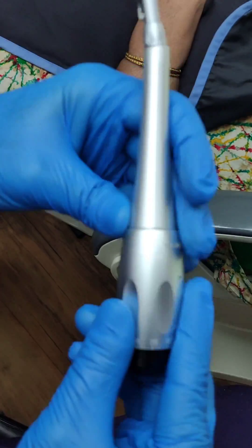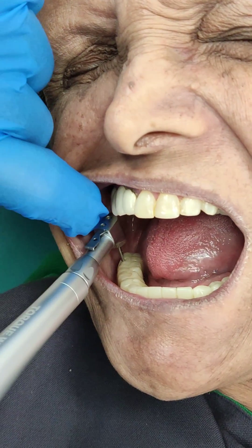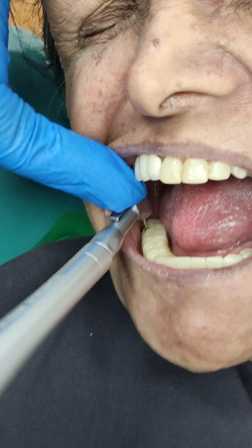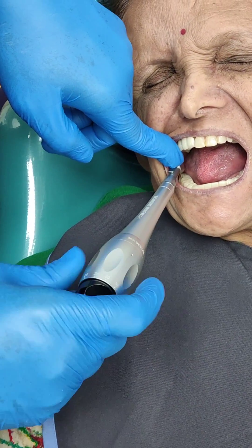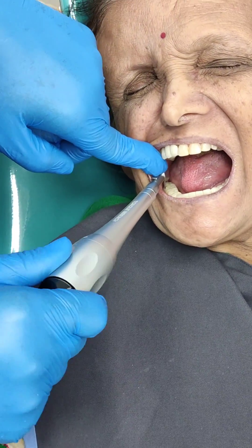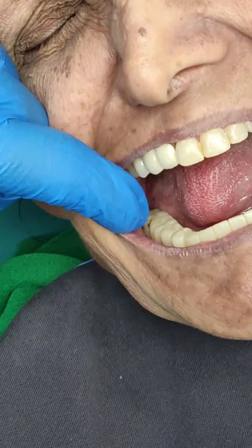On the torque wrench I can set the Newton centimeters torque value, and because of this head design I can easily go in, take access, and all I need to do is hold and turn. Even the most difficult area to access in the oral cavity is now fairly easy. You can appreciate here that we've managed to place that screw back into its final position.